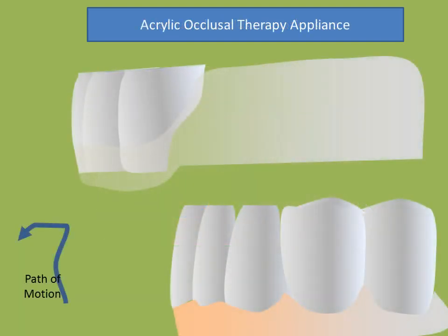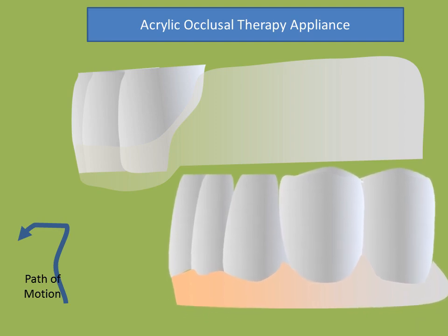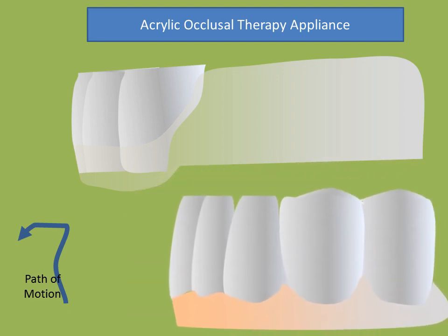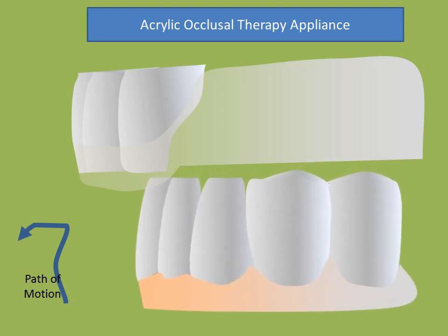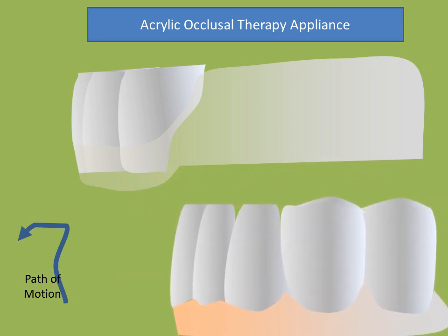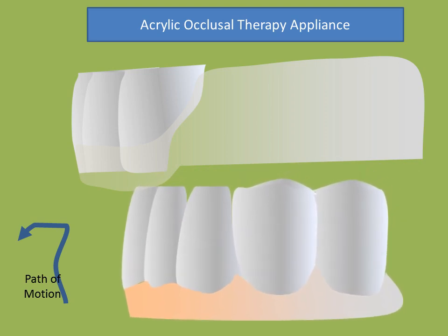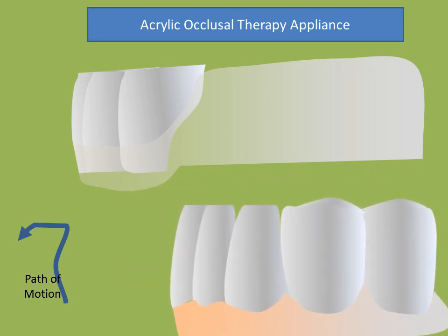To begin, it will be necessary to restore the patient's vertical dimension of occlusion with an occlusal therapy appliance. The appliance will provide freedom from the centric relation position into a comfortable anterior acquired position. Anterior disocclusion will be provided with the acrylic splint. This will test the patient's ability to tolerate a new vertical dimension as well as her tolerance for a removable appliance. Excellence in dentistry, Marie.